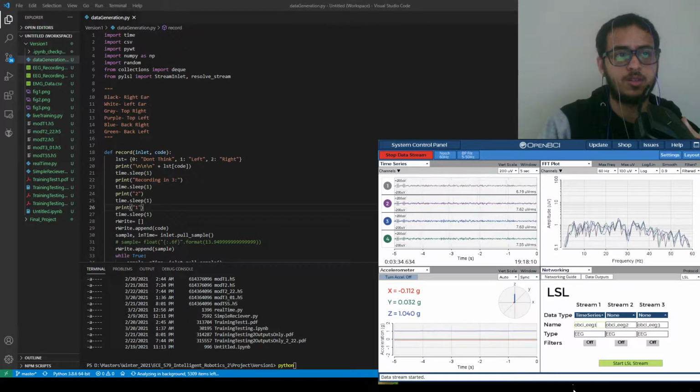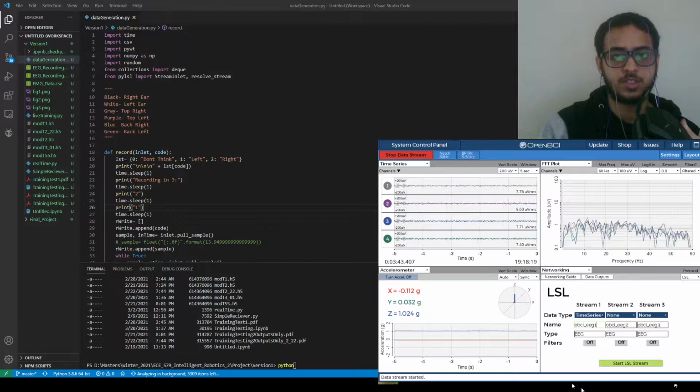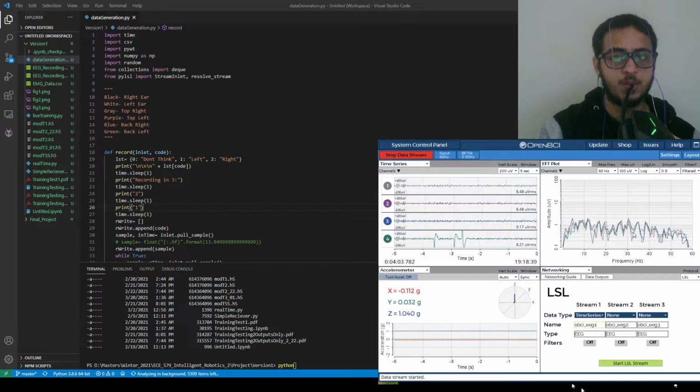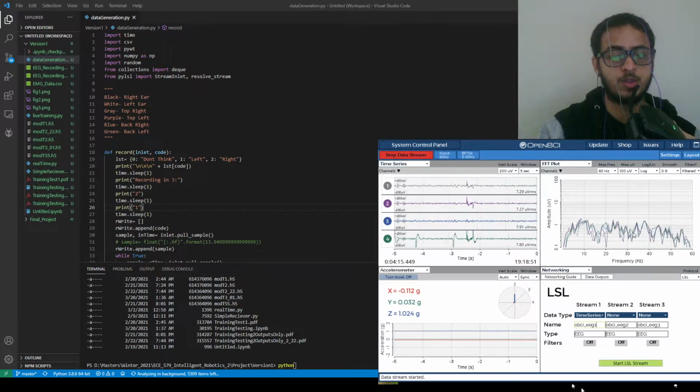So right now I'll try to concentrate just to check if the connections of the electrodes are correct. If I close my eyes for a certain duration, then the 10 hertz frequency amplitude should rise and others should remain pretty low. So let's test it. As you can see, the 10 hertz frequency amplitude was quite high for a certain duration, and then it dropped back. So using this concept, I try to think left or right, or don't think, to control something.